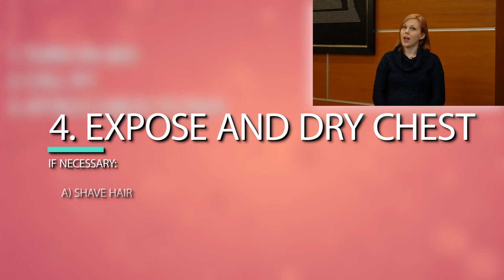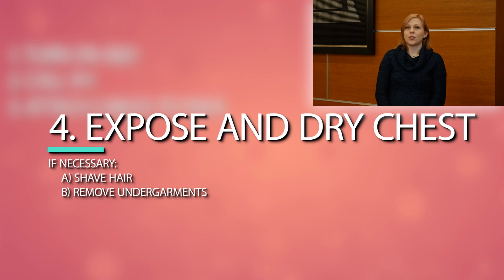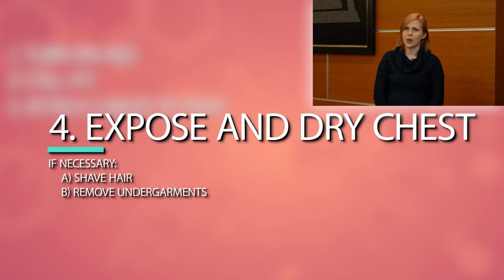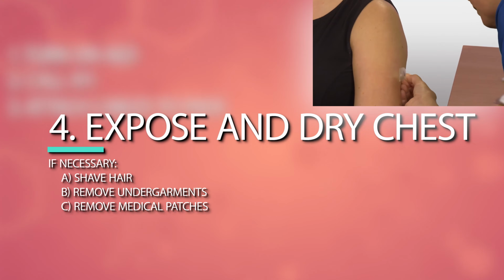If the chest is very hairy, and you have the necessary equipment, such as a razor, shave it. If there is an undergarment, such as a bra, remove it. Both the strap and the band are in the way of correct pad placement, and an underwire could present an arc burn risk. Modesty doesn't much matter in a life or death situation. If there are medical patches, such as nicotine patches, remove them.